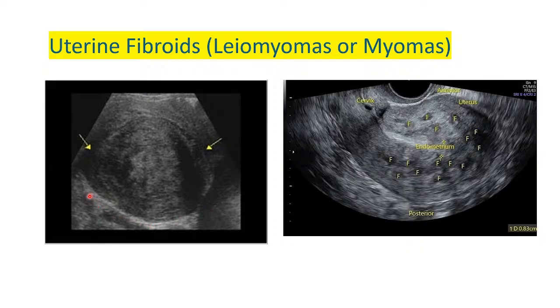So a lesion or a mass that enhances posteriorly is mostly a sign that it is a benign mass. So this is a fibroid. It's well outlined. It's not invading the surrounding tissues. It is having a mass effect. You can see this part of the uterus is sort of pushed up, so that is the mass effect of the fibroid. So this is one type of fibroid that we have there.